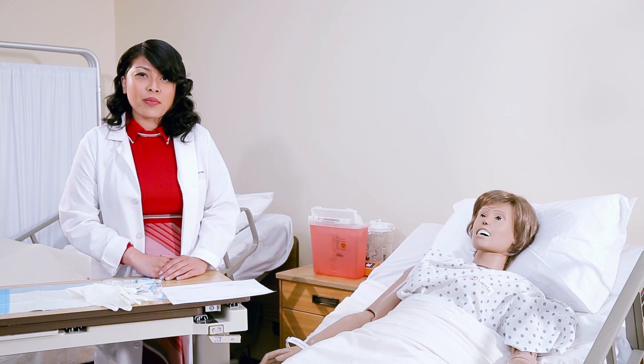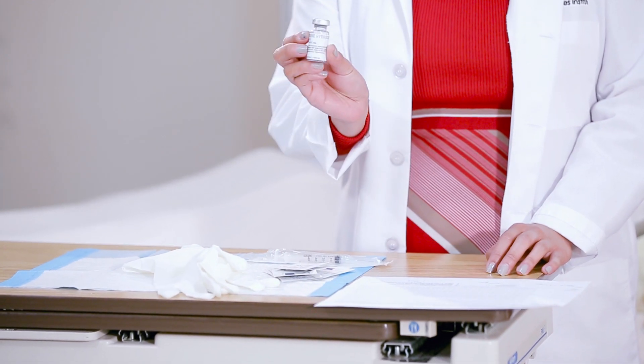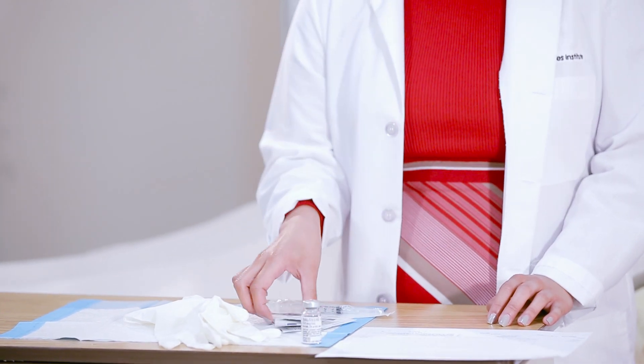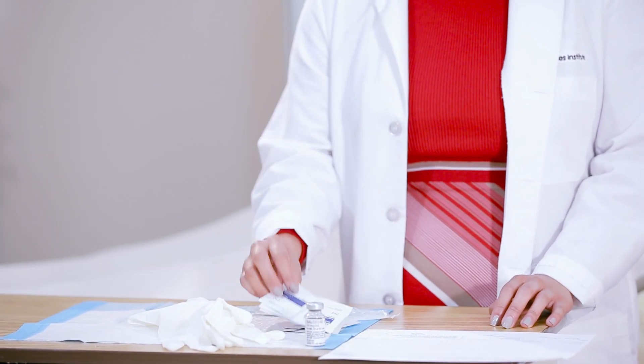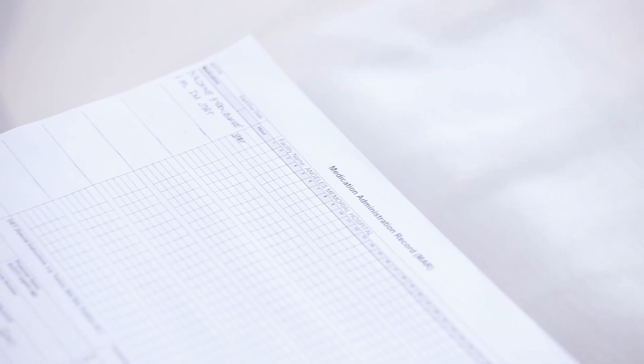First you want to make sure that you have all the supplies on hand: a pair of gloves, the medication, alcohol wipes, the proper syringe, and the MAR. We have here the patient's name — you double check the patient's with the matching medication and we're going to go ahead and start the drawing up.